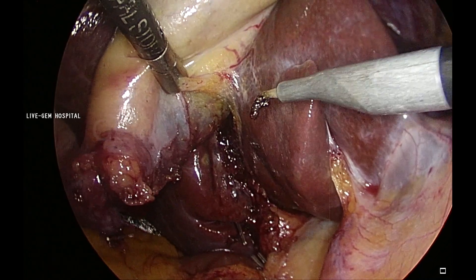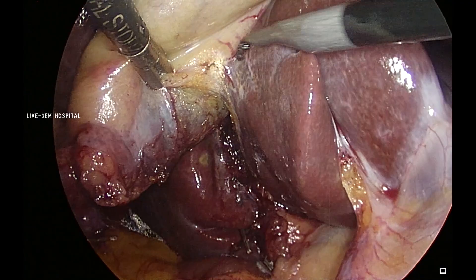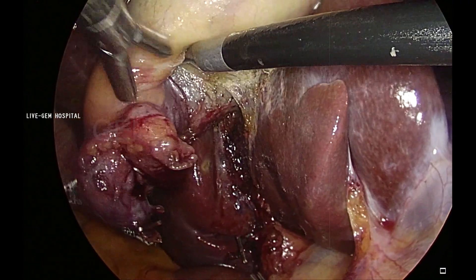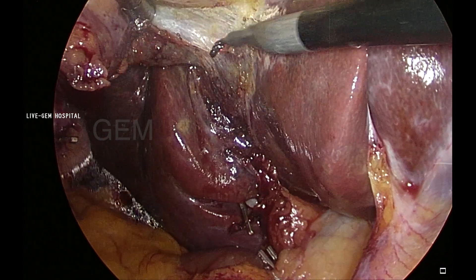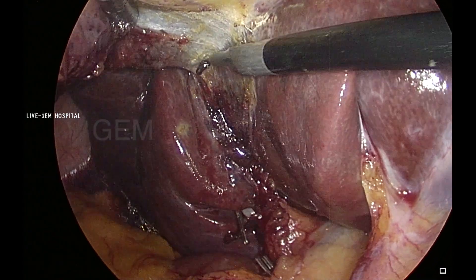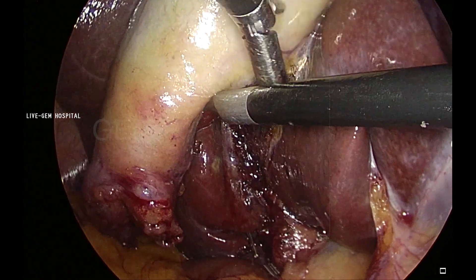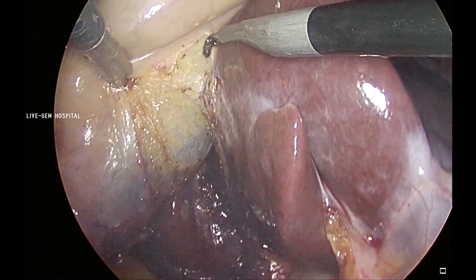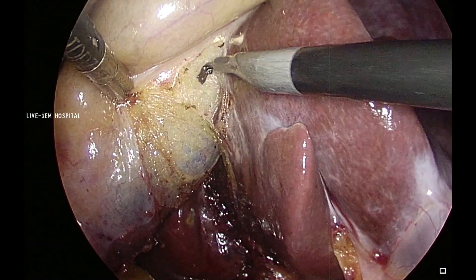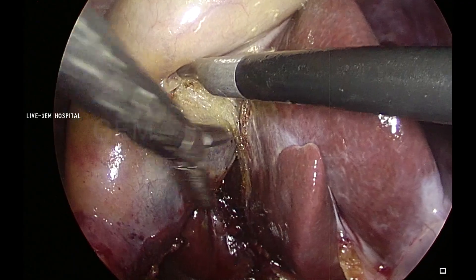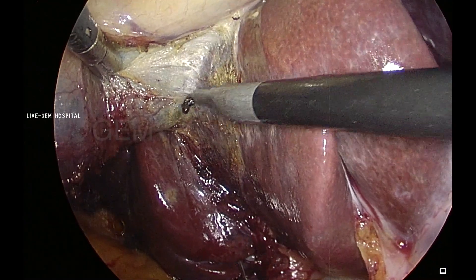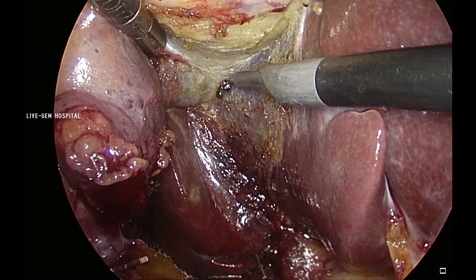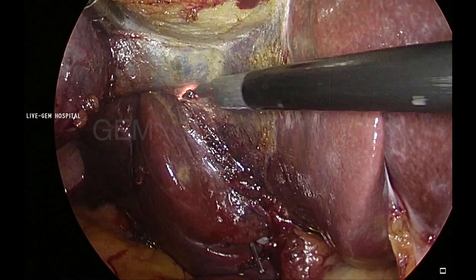Always I work with the shoulder of the hook. Now you can see I am holding the posterior wall and lifting — see how much the plane is exposed when I hold the posterior wall of the gallbladder. This traction is the key for gallbladder separation from the liver bed. We can do it without any energy device if the traction is good — otherwise you may enter the gallbladder or you may enter the liver bed. That is why I keep marking the left hand traction in the video — the left hand is the key for any laparoscopic surgery.